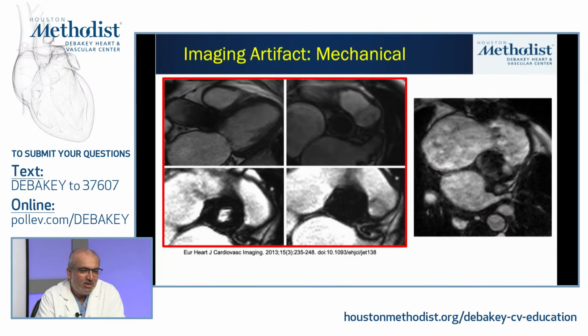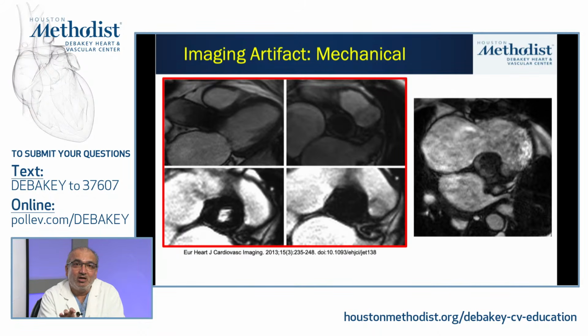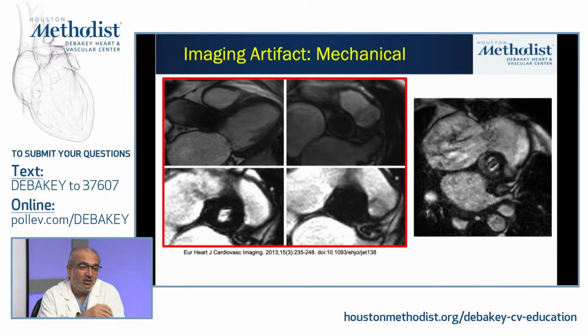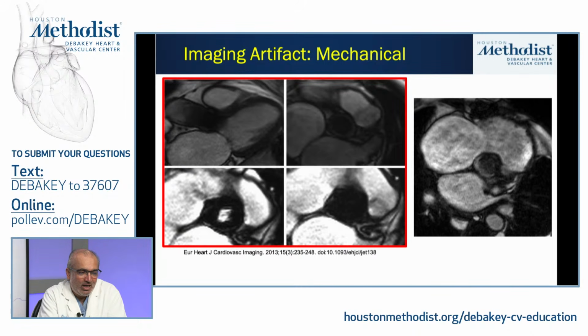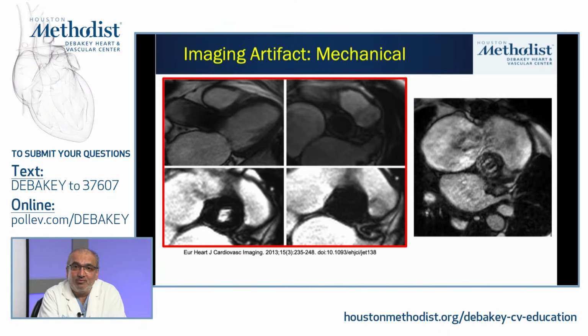So the first thing to keep in mind: we talked about safety, but the other important thing is the artifact that you get. Mechanical valves in general, metallic valves, are going to give you a pretty significant amount of artifact.